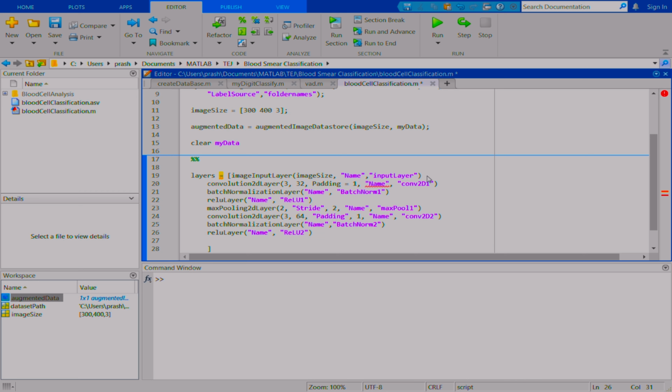We'll run the whole code with this, and if the time required or the accuracy is not very good, then we will make changes in this particular set. Right, so after this ReLU, I should go for the output layer.